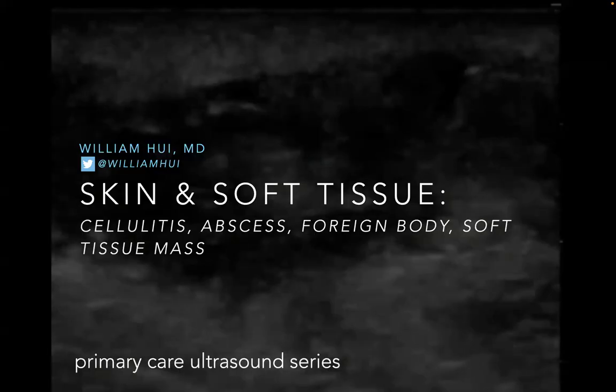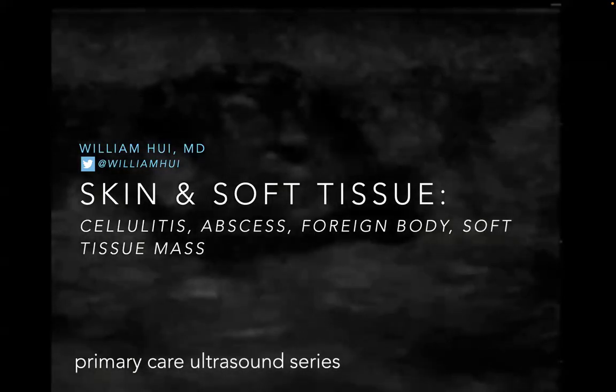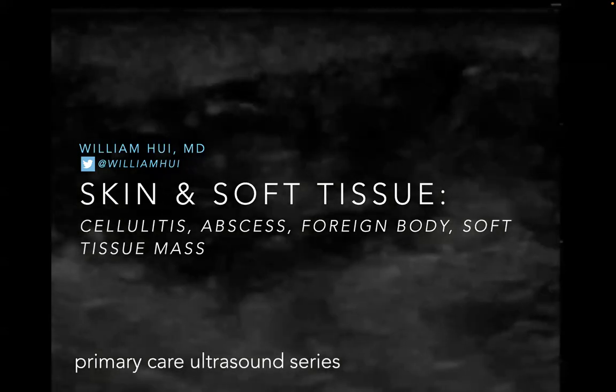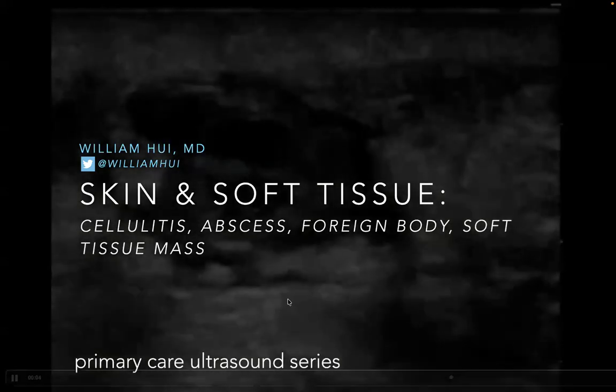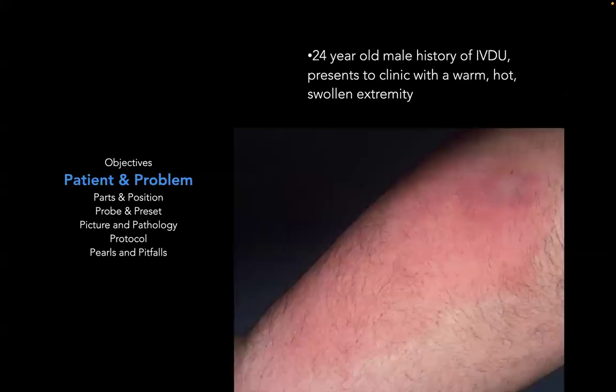All right, so now we are going to be talking about skin and soft tissue. We'll be talking about cellulitis, abscess, foreign bodies, and soft tissue masses. The objectives for this are differentiating abscess from cellulitis, identifying foreign bodies, identifying common primary care masses, how to do a limited soft tissue POCUS, and then recognizing common pearls and pitfalls. We'll start off with a case.